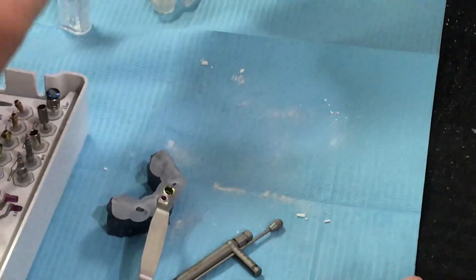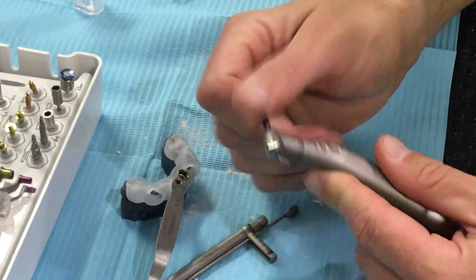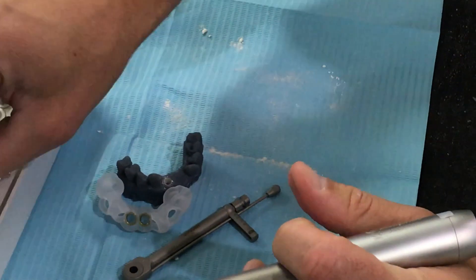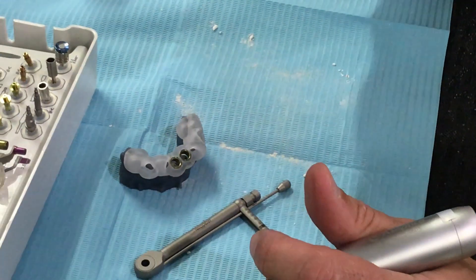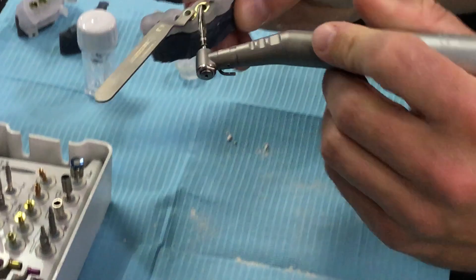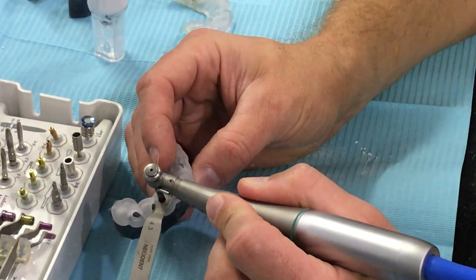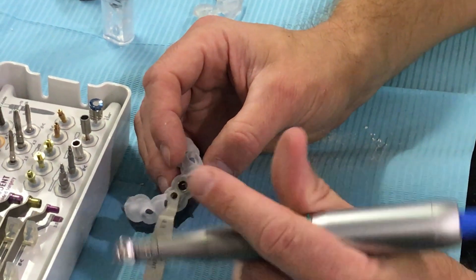I'm going to go one more since I'm doing a 4.3 by 13 length implant in the drive. Now I remove my 3.5, my guide's back on, and I have a 4.3 spoon for the 4.3 drill. I place that in, make sure it's flush on the side, and take this down to 13 as well.